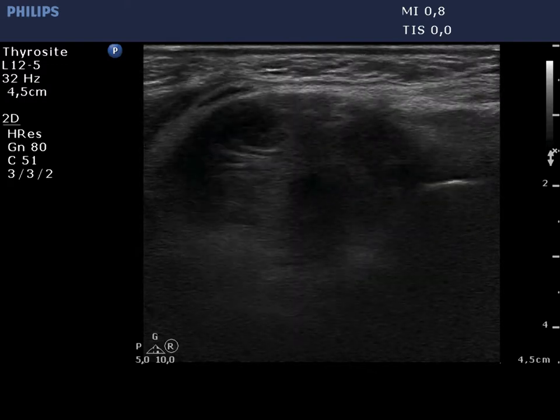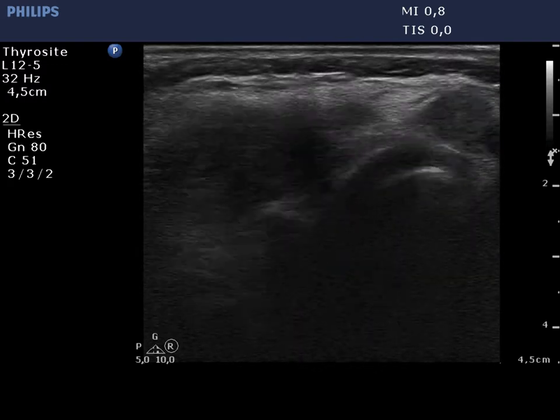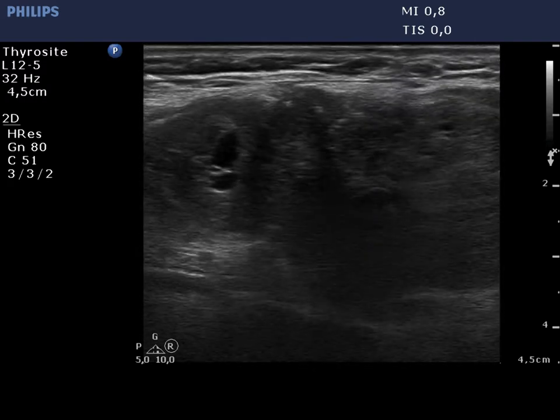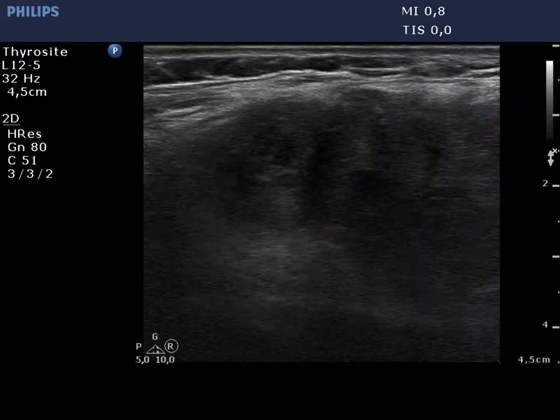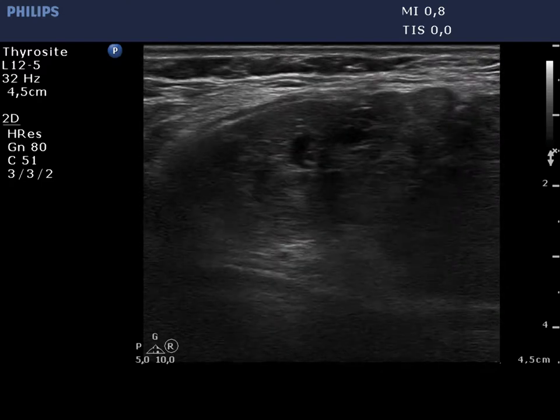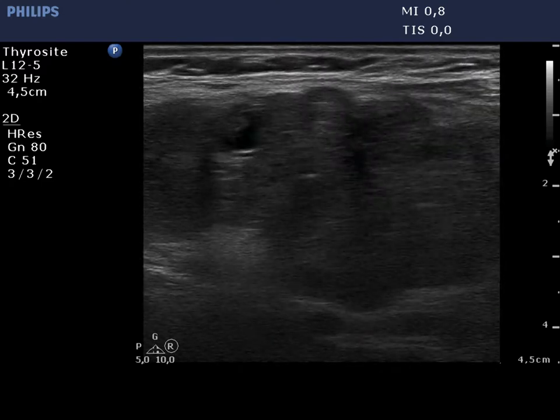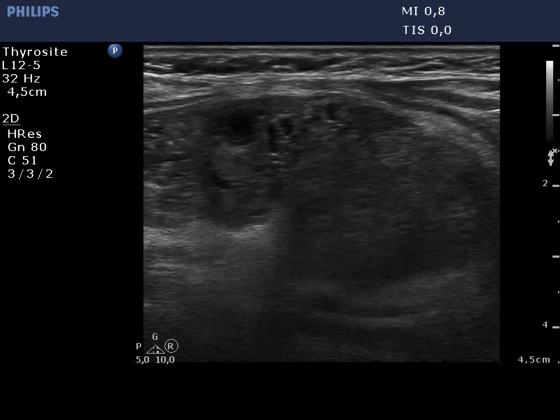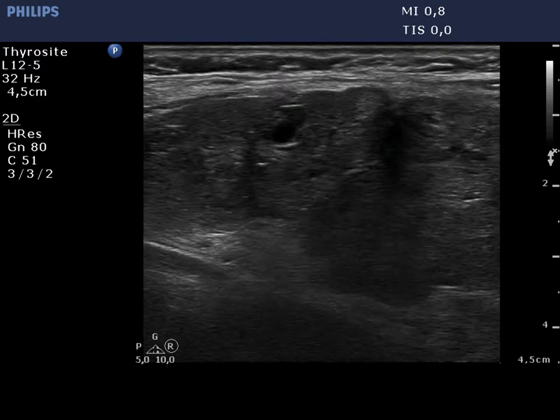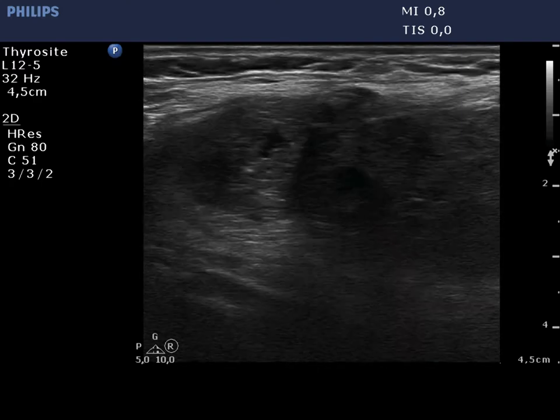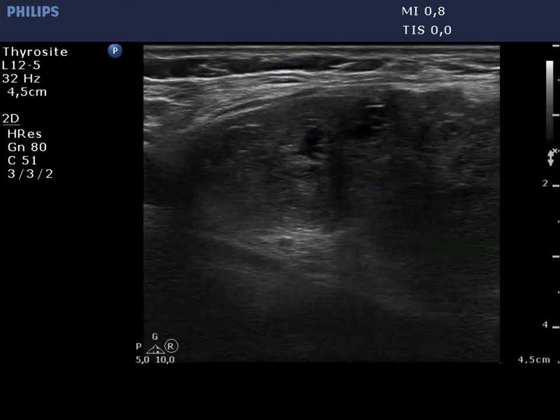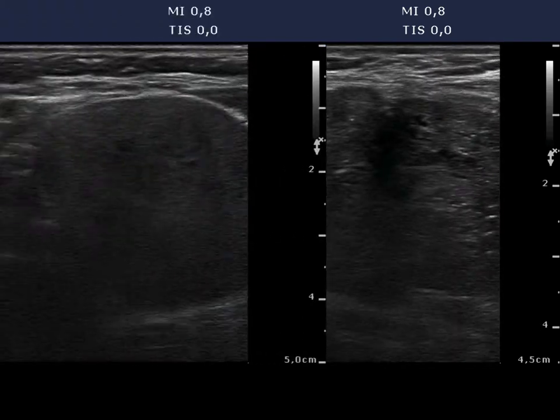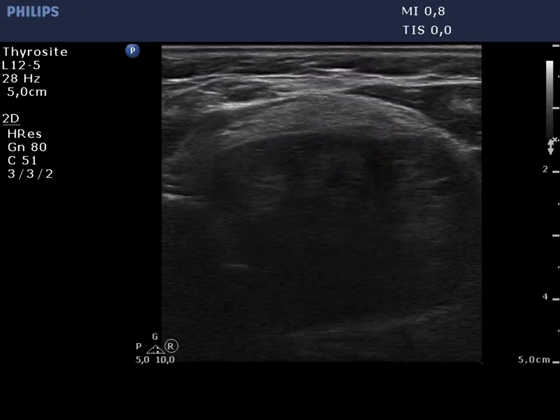The right lobe is composed of a central hypoechoic area surrounded with a thin echoic-normal rim. The surface of the hypoechoic field is uneven, irregular, but sharp. This is the typical presentation of a subtotally resected thyroid.